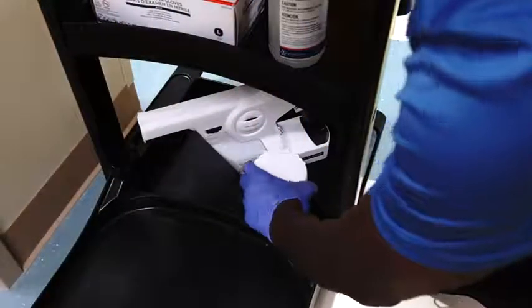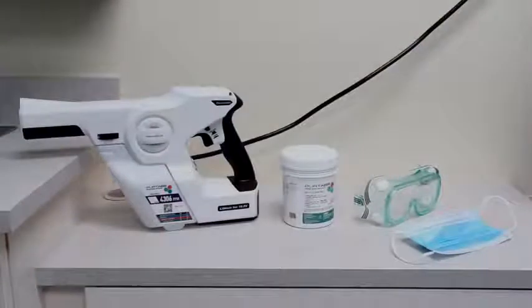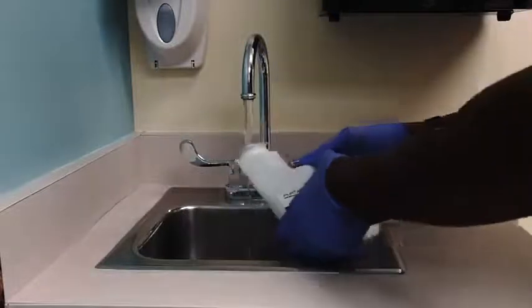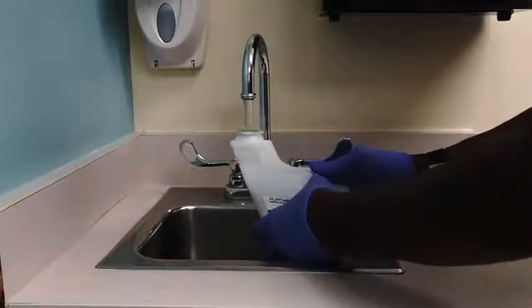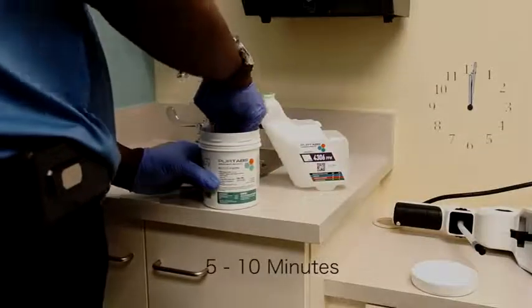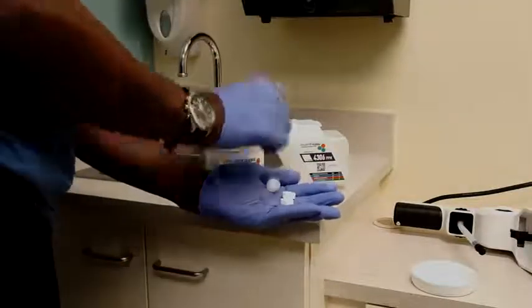Assemble the Protexis sprayer and tub of Purtabs from the workstation. Gather necessary PPEs, which include goggles and face mask. Remove the tank from the sprayer and fill the 32-ounce tank with warm tap water up to the fill line. Drop 4 of the 3.3 gram Purtabs tablets into the tank one by one. Allow to fully dissolve 2 to 3 minutes prior to inserting the tank back into the sprayer.